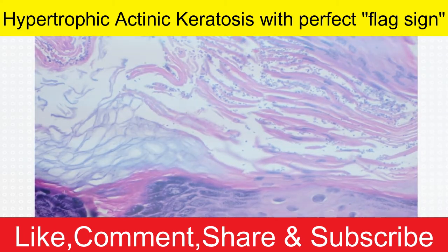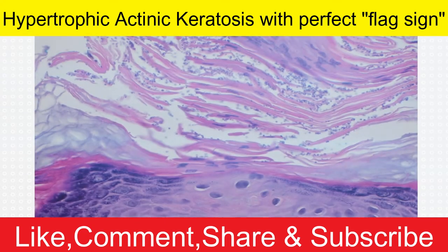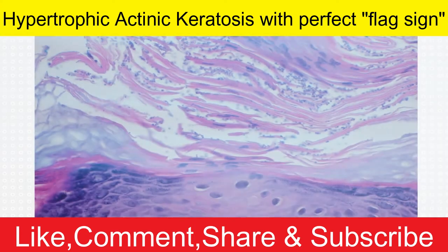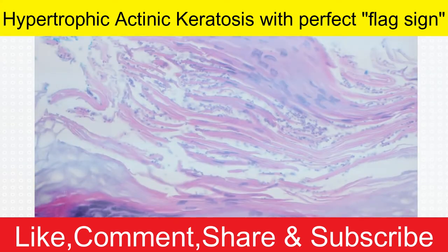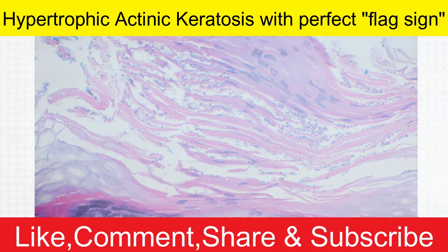It's really hard to get it. I don't have a higher power objective. This is on 40x, a 400 times magnification, but you can see the round yeast, and they've got little tiny buds out to the side. I'll have to find a good picture of that and insert it in here before I put this online.